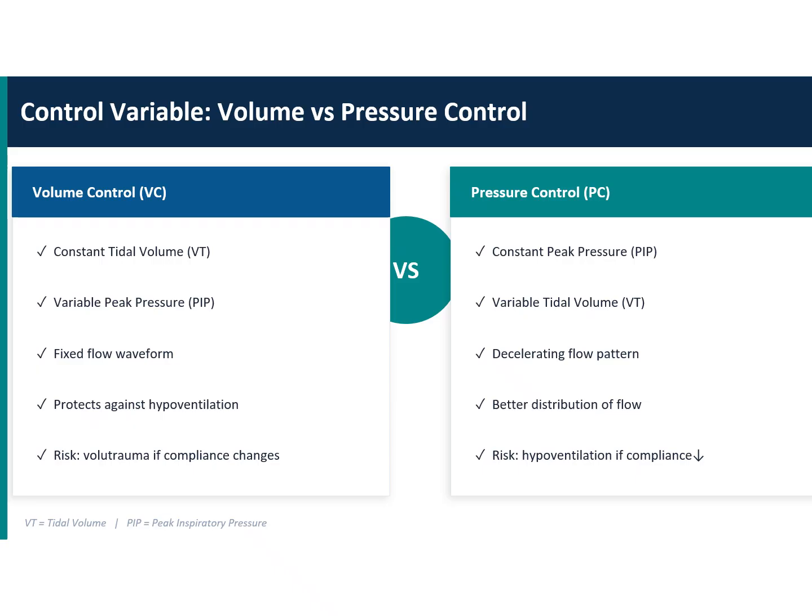In pressure control ventilation, we adjust IE ratios. Basically, it is the same thing: high flow is equal to less inspiratory time. So if you are decreasing inspiratory time, the flow will be high. Some of the ventilators, even in pressure control and volume control, give an option to adjust the IE ratios rather than adjusting the flow. Both are the same thing, doesn't matter.